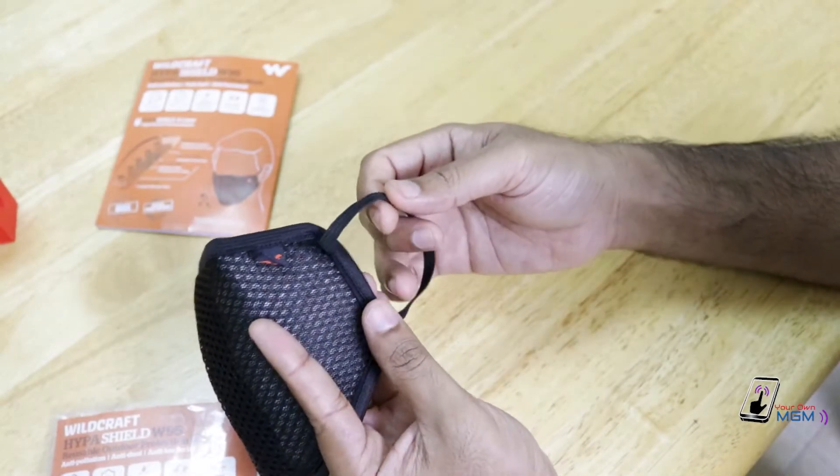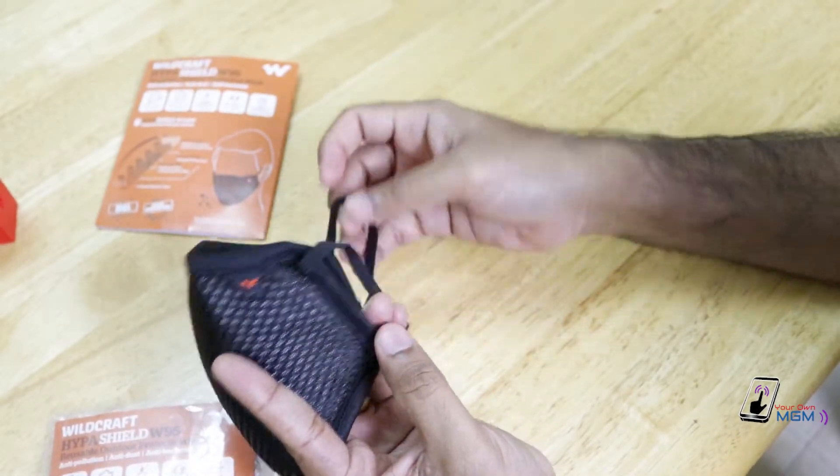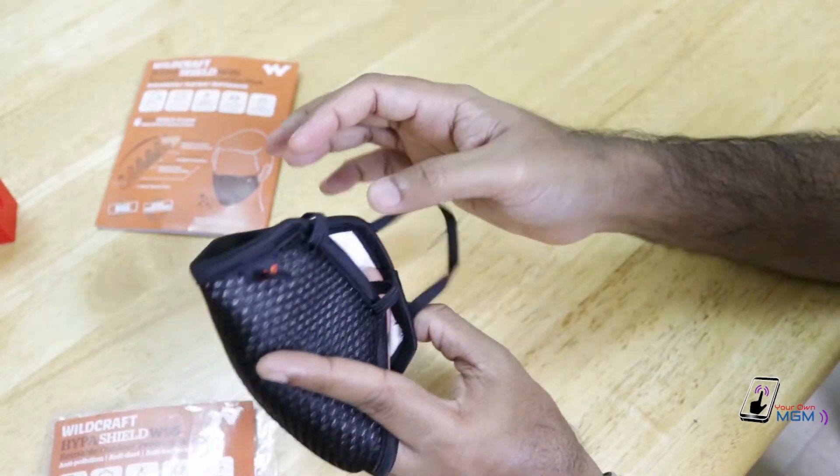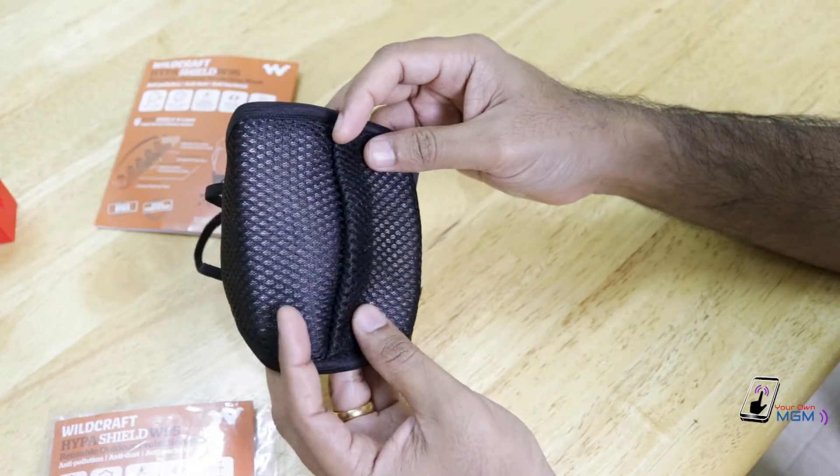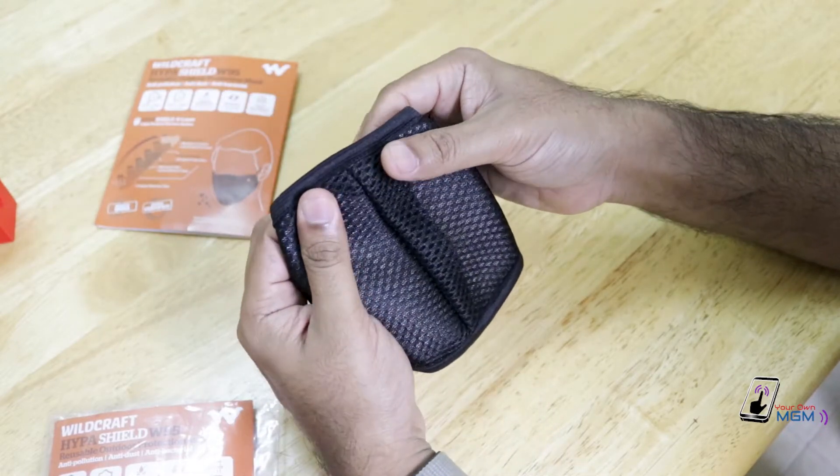There are two elastic hooks. The inner layer of the mask includes a nose clip.